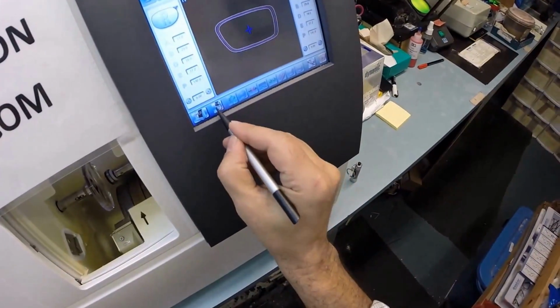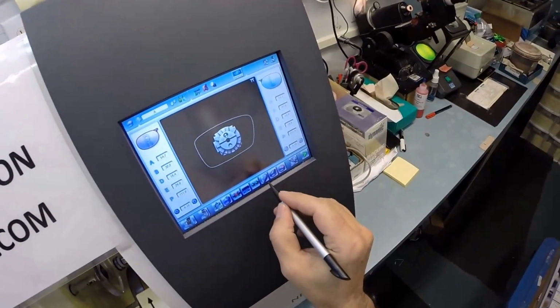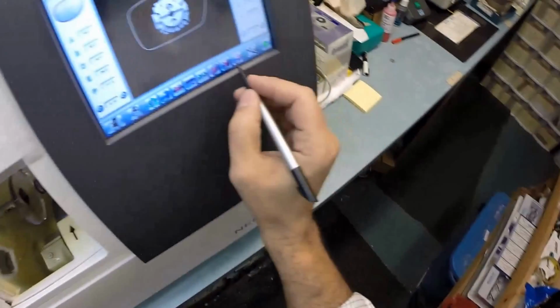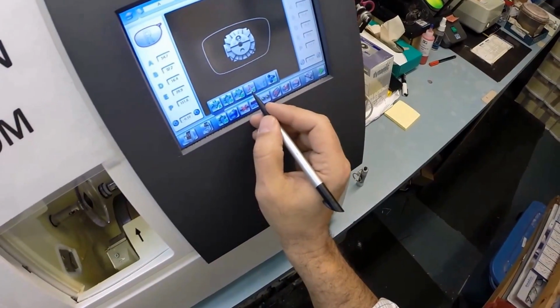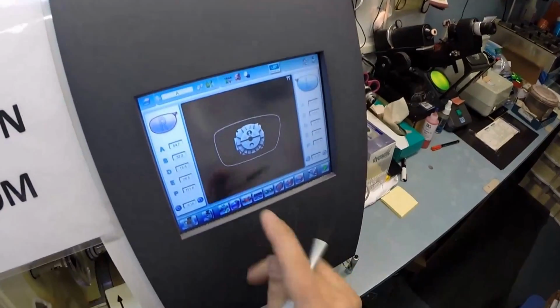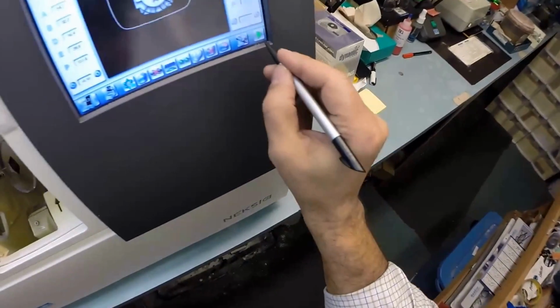But I'm going to hit that button there. That's the little tracer. That's what that is called. It's going to pull up the shape of your lens. I am not going to polish the edges. I am not going to put a bevel on the front of the lens, but I am going to have one on the back. These are polycarbonate lenses. If it was plastic here, mid-index, Trivex, I could change what it is, but we're going to keep it on polycarb, the little PC there. That is not politically correct. That is for polycarb. And we're going to hit the green arrow, which is start in every language.